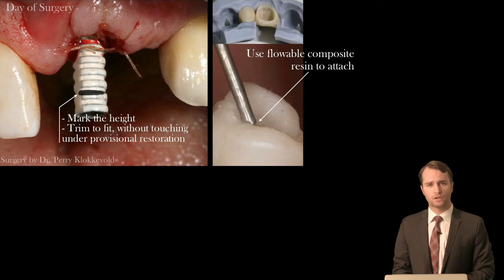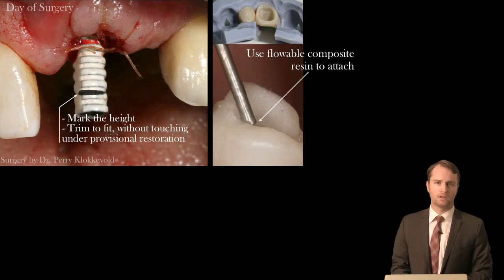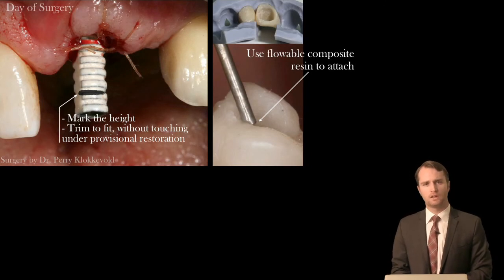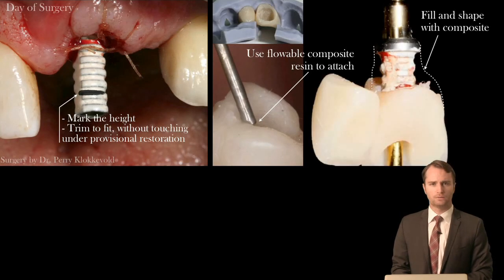It is important not to inject the material down the screw access hole, obviously, and the composite material is injected between the abutment and the interior of the shell. Sometimes I have found it useful, when we have excessive space in the area, to initially line the interior of the acrylic shell with the composite resin and initially line the outside of the provisional abutment with that composite resin as well, helping to create a linkage between them. Once we can visualize that we have sufficient composite resin in between the shell and the abutment, it is now time to cure it and remove it.